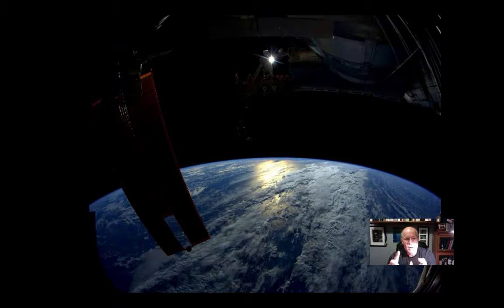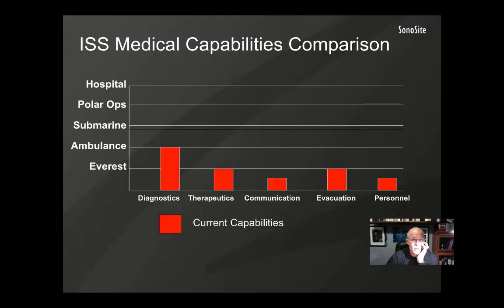We do not have X-ray, we do not have CT scan, we do not have an MRI, and if you consider, in terms of mass, power, volume, money, those modalities are very heavy. They require quite a bit of training, etc. Portable ultrasound, you've got the device right there. The training is really minimal, relatively speaking, and you can get very, very good images. You can do dynamic imaging as well as comparative views in the extremities. So again, it's a perfect device for us in remote environments.